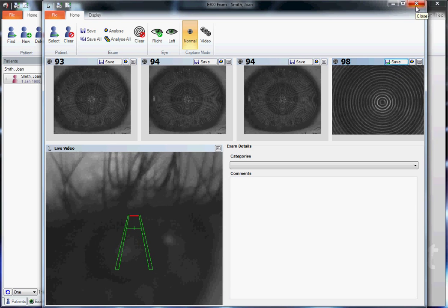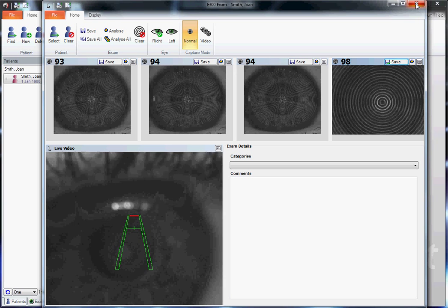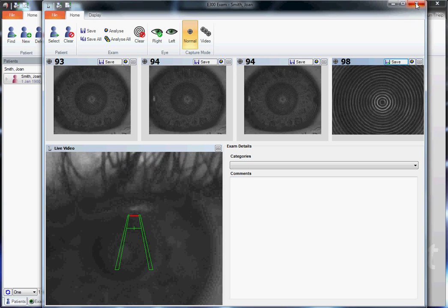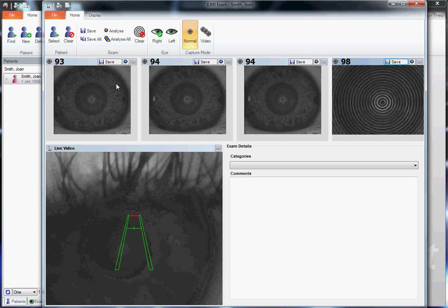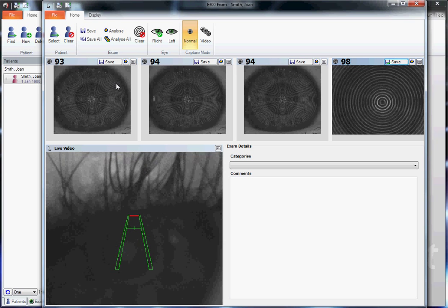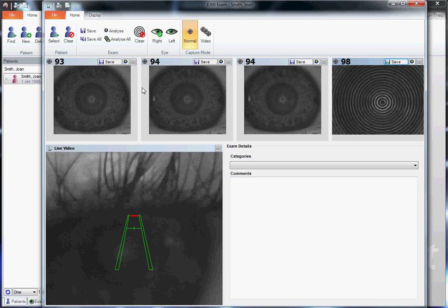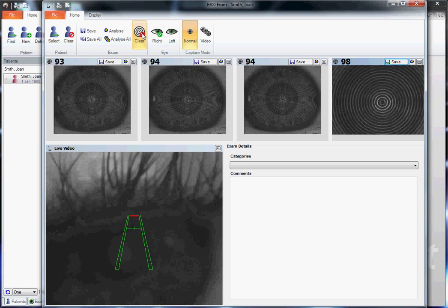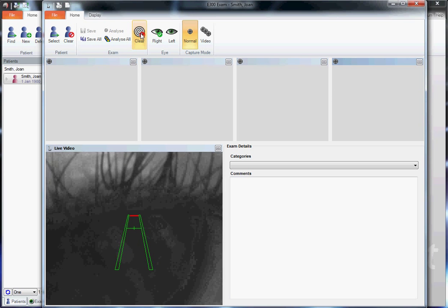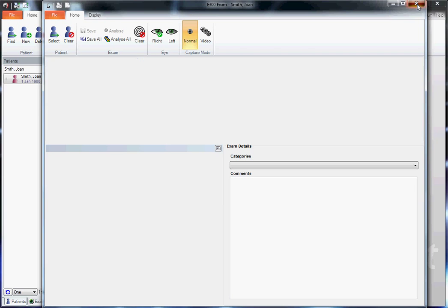We can take additional images on each eye. That way we can be certain we're looking at the true shape of the eye by taking multiple images of the same eye. We can compare them against each other to see if the information is reproducible. Always save the best one, clear images, and start again by taking additional images on the same eye.